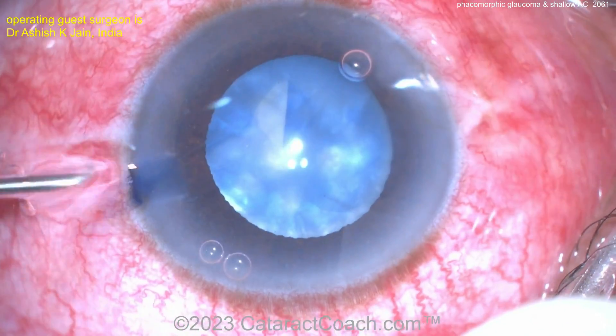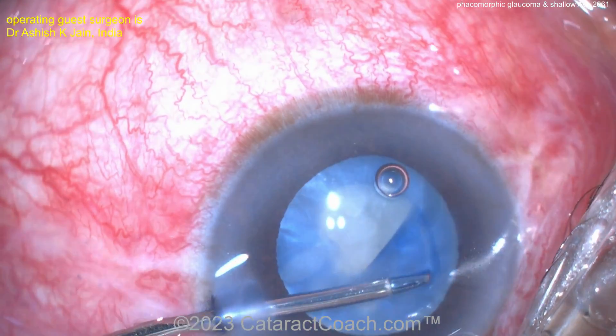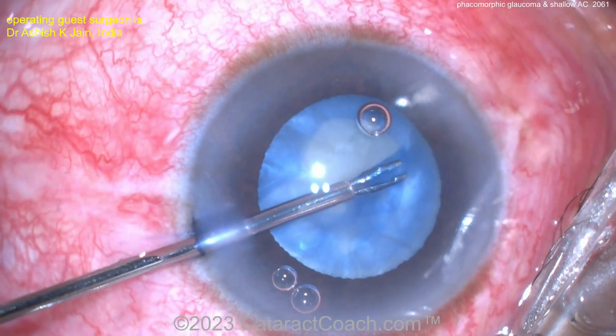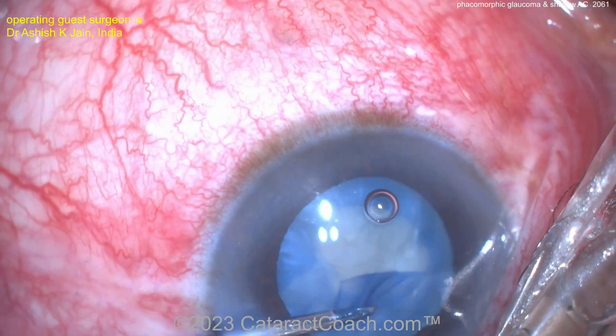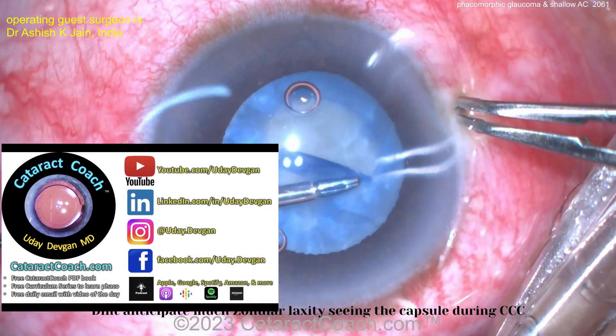Getting the rhexis done. I like the idea of using a cystotome for that rhexis — or even better, micro forceps. Notice how this is all done through the paracenteses. These tiny forceps, which are probably 25-gauge, allow you to get a nice rhexis done.